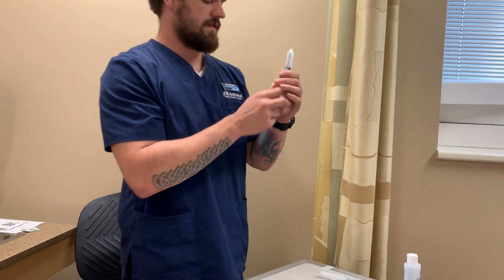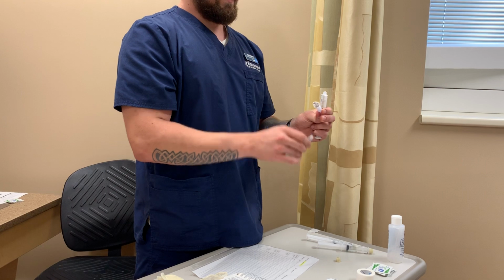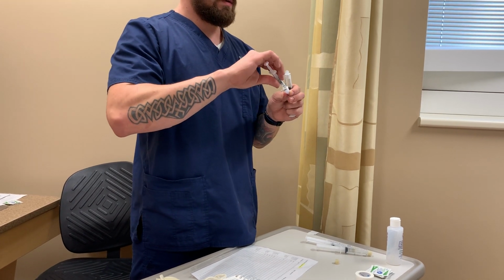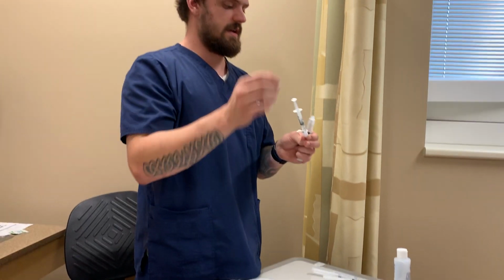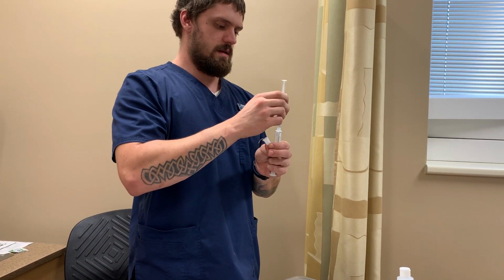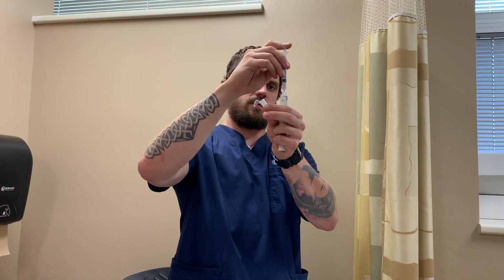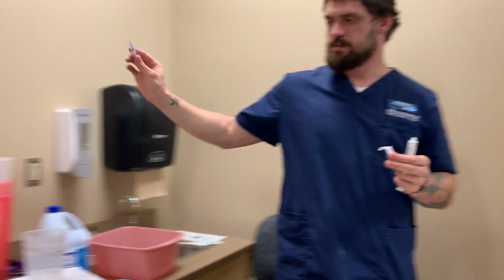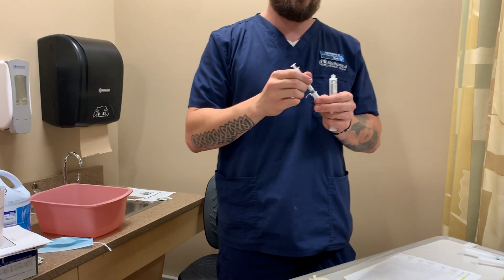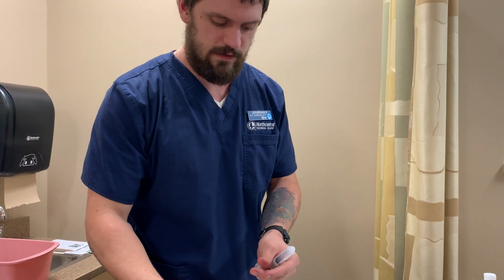And we are going to give ourselves some room here. Making sure the cap is up so we are sterile. We connect to our VAD. And we put the medication in. Now, this would go into our sharps in most places because a VAD is considered in most facilities a sharp. But in this case, we are holding on to this.